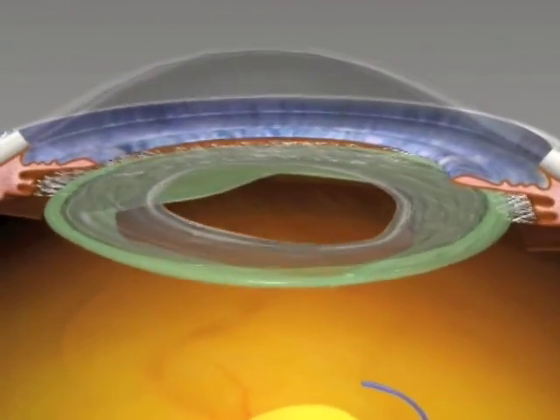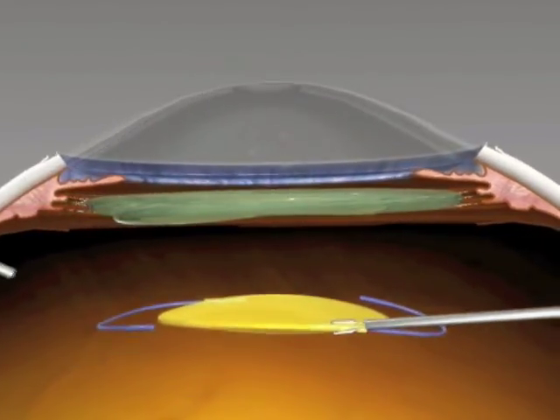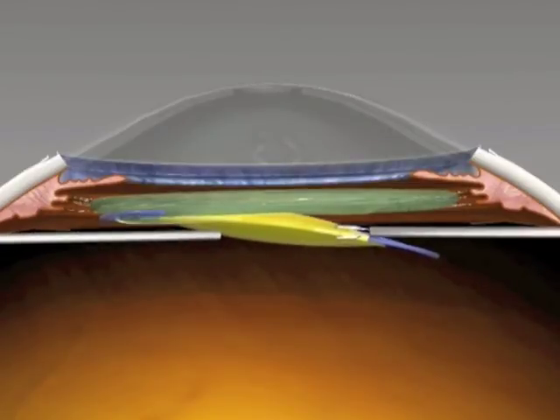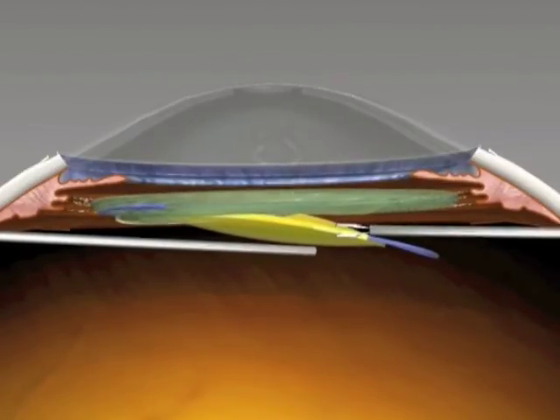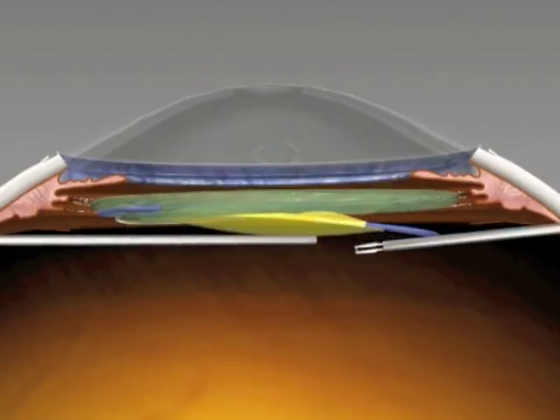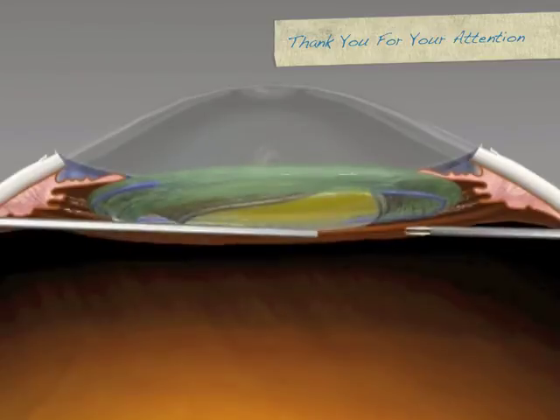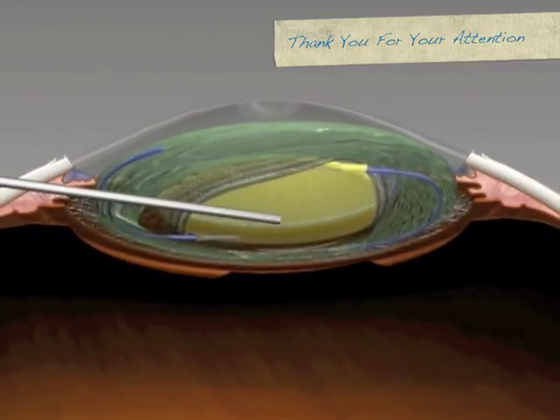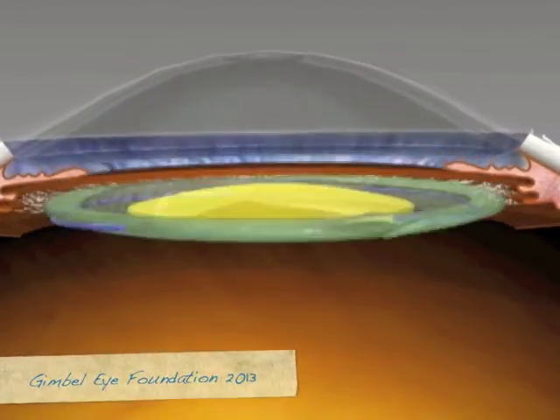This animation illustrates that retinal surgeons can also use membrane optic capture, if the opening in the membrane is the appropriate size or can be made to the appropriate size, rather than removing these lenses or trying to fixate them to the sclera, or to remove them and use an anterior chamber lens. So this is membrane optic capture.